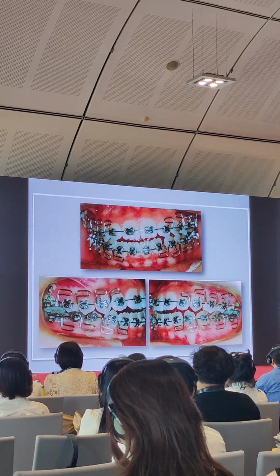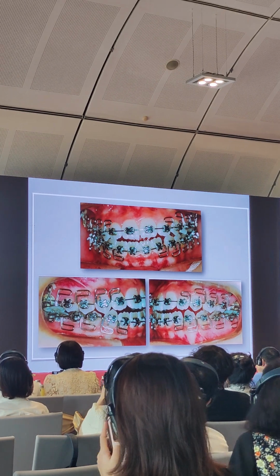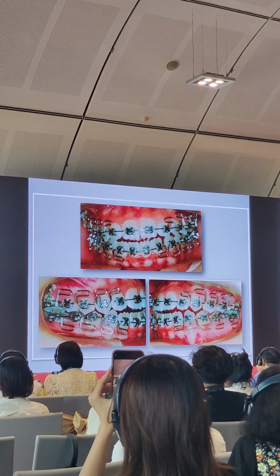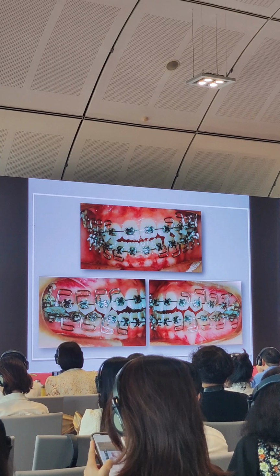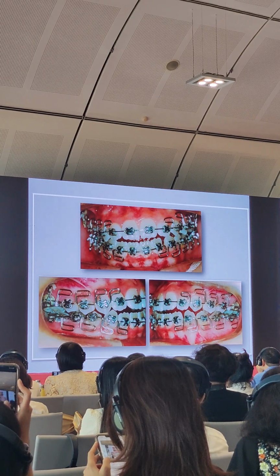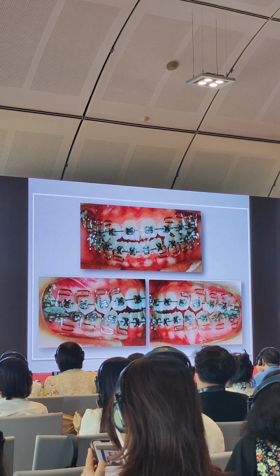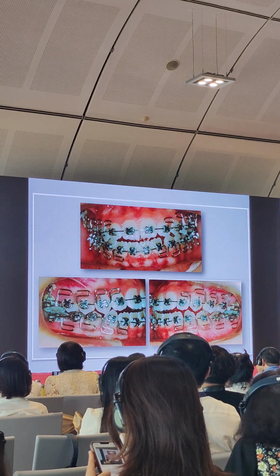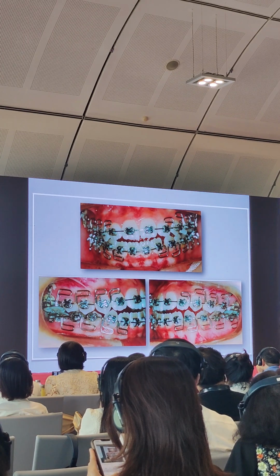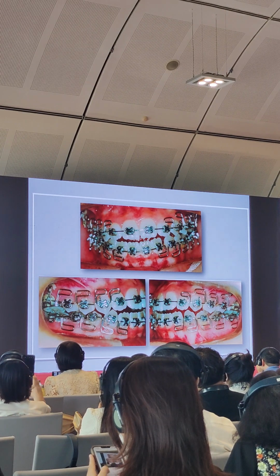Patient came back, yeah, the bite closed, but I can see now my molar on the right side getting into a cross bite. But during this time, I was so happy, because the bite started to close. So that is my main goal, to close the bite, and then I will just deal with the cross bite on the molar later, by correcting with the use of the wire. It would be better that you place something also on the lingual, to intrude the molar without any side effect on the molar area.